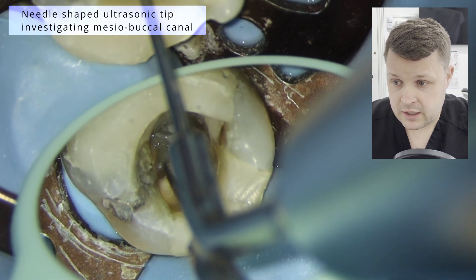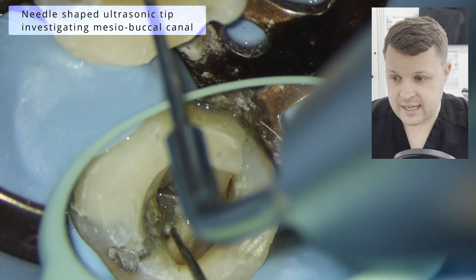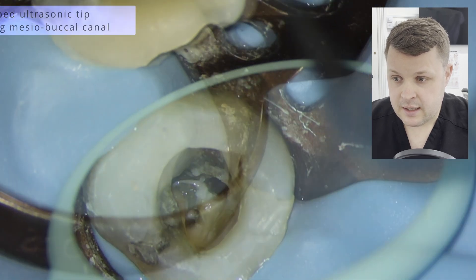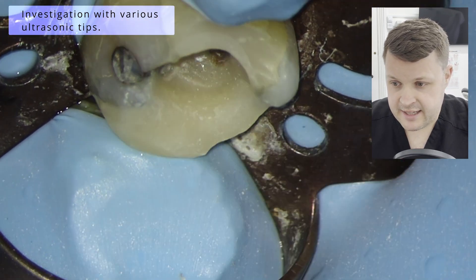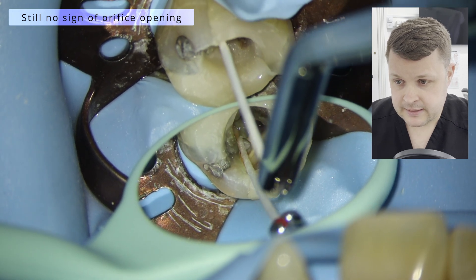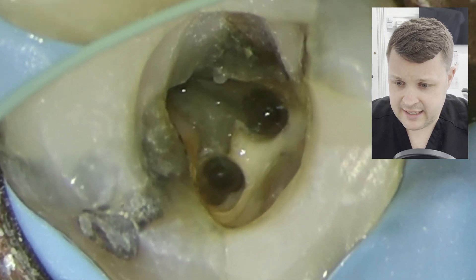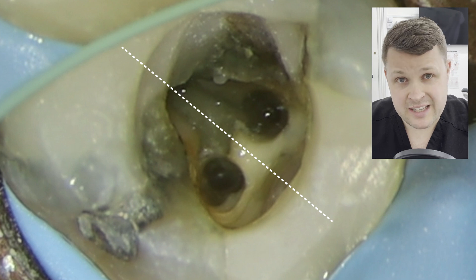Now we're moving on to the mesio-buccal canal. I haven't shaped the mesiolingual because I just wanted to get patency in all the canals first. And I'm just using this needle-tipped ultrasonic tip along with the ball-ended just to find this canal orifice. I'll see I'm using paper points there as well, just to remove some of the wetness from the canal area.